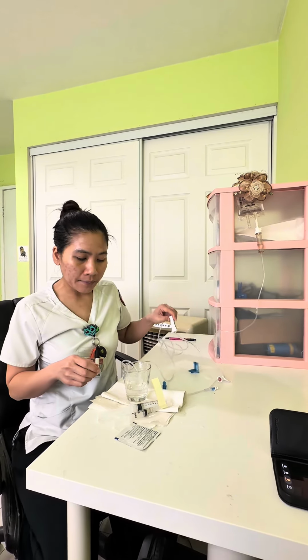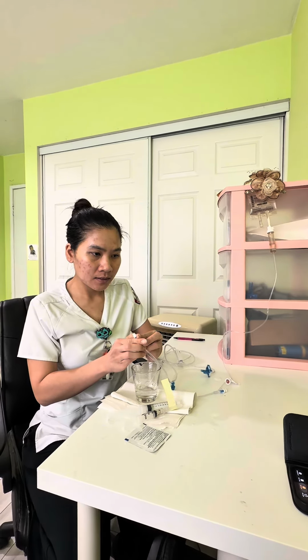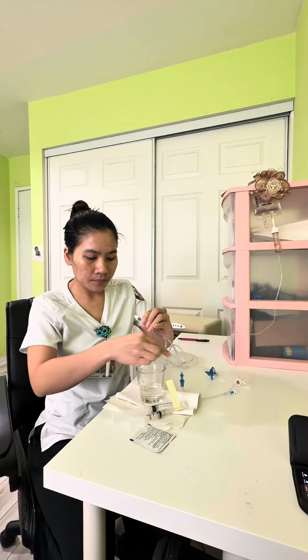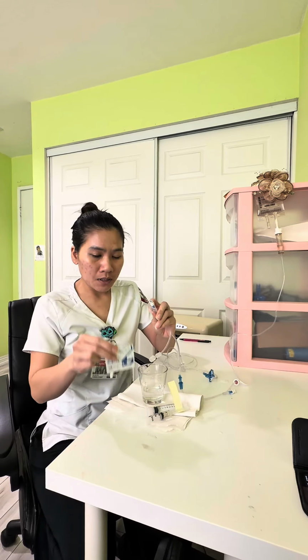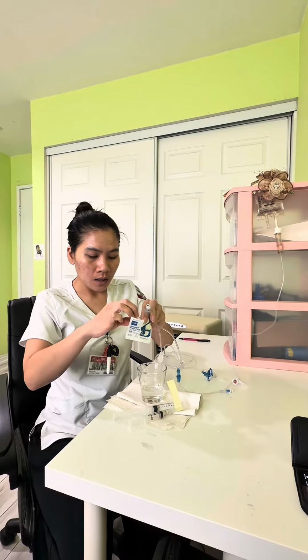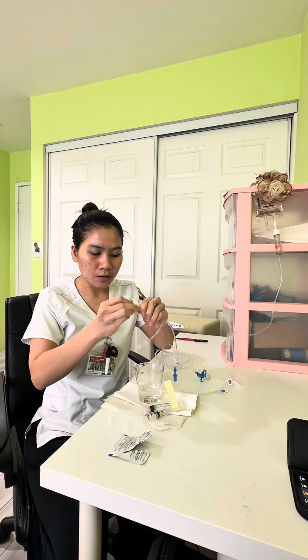So I already clamped it. I clamped it as well. I can clean the port. I clean it for 10 seconds, and then allow it 10 seconds to dry.